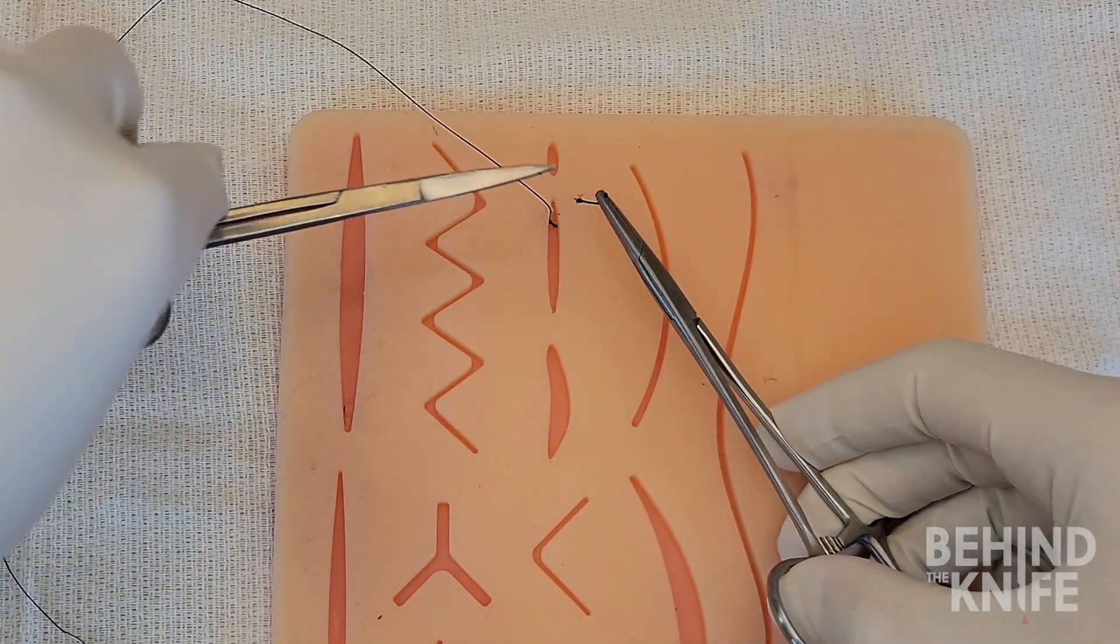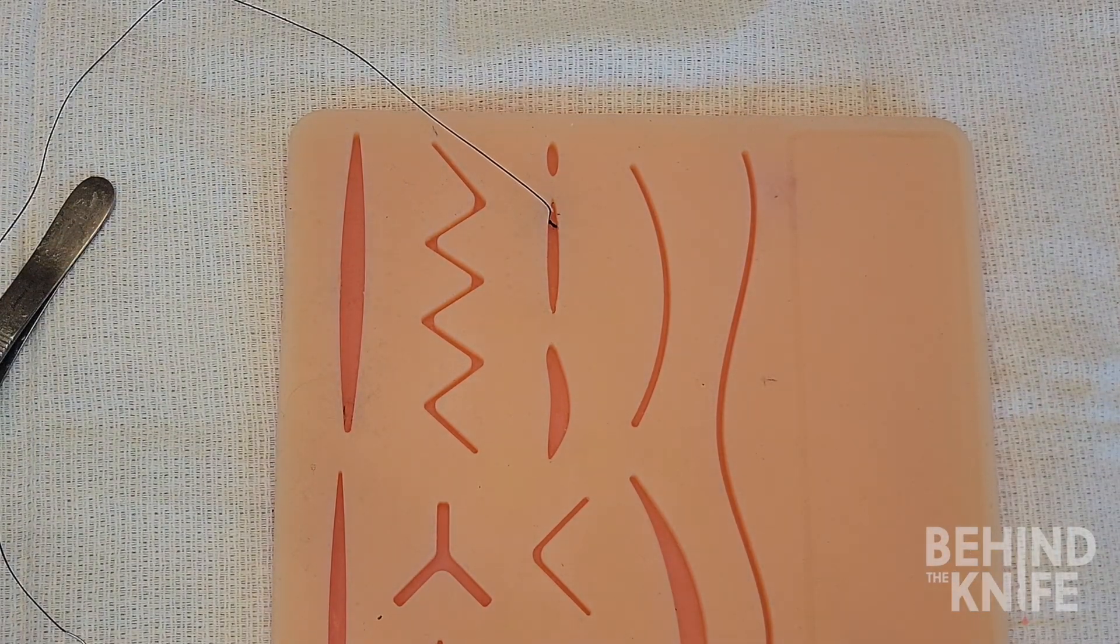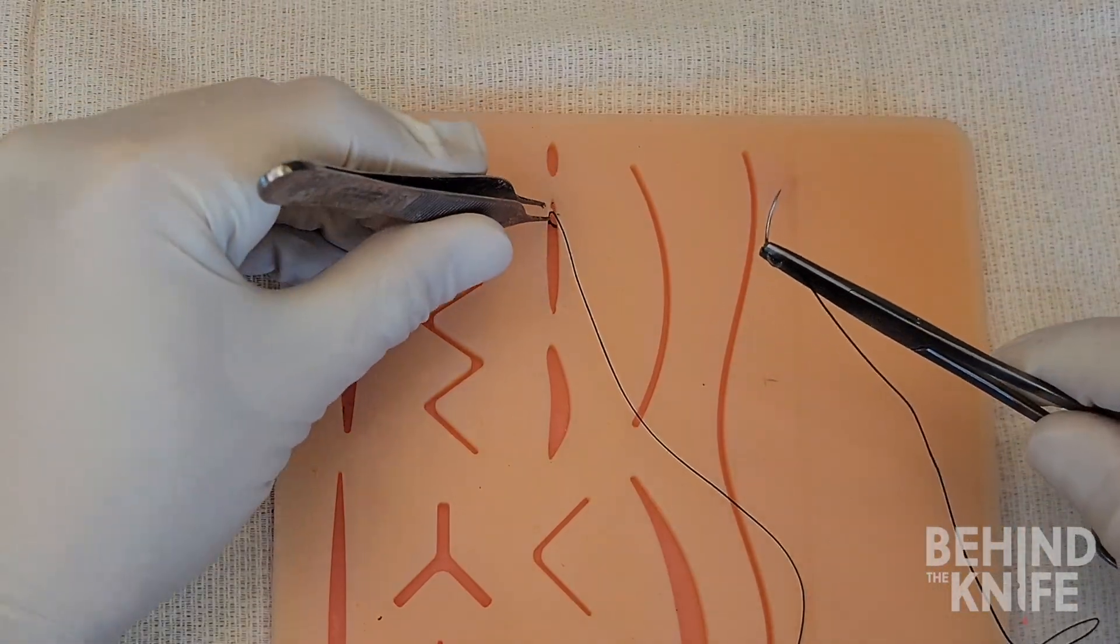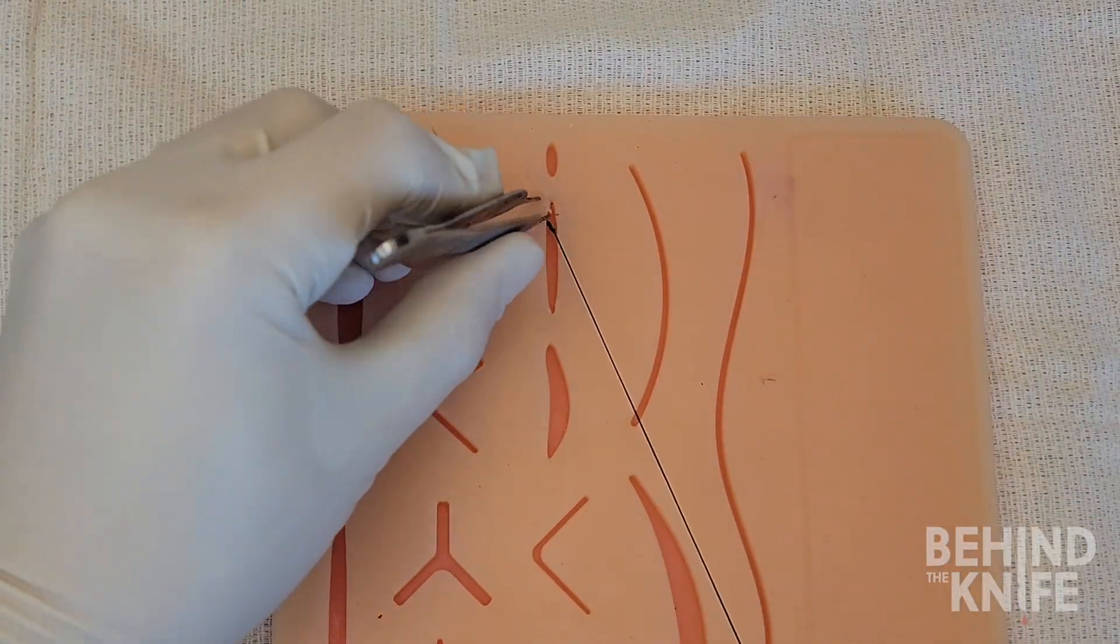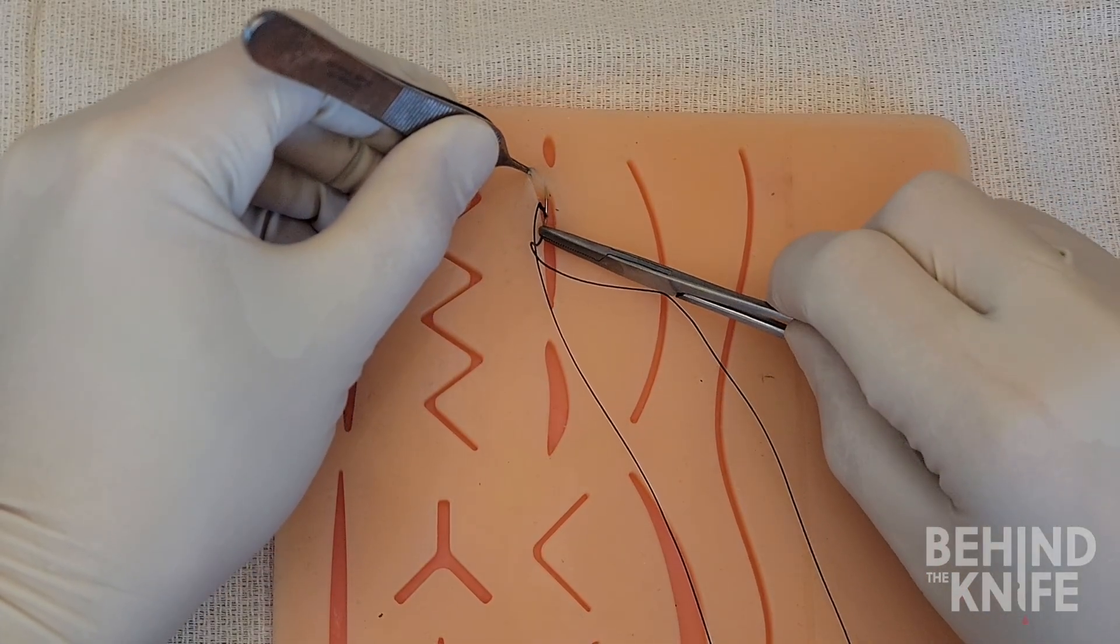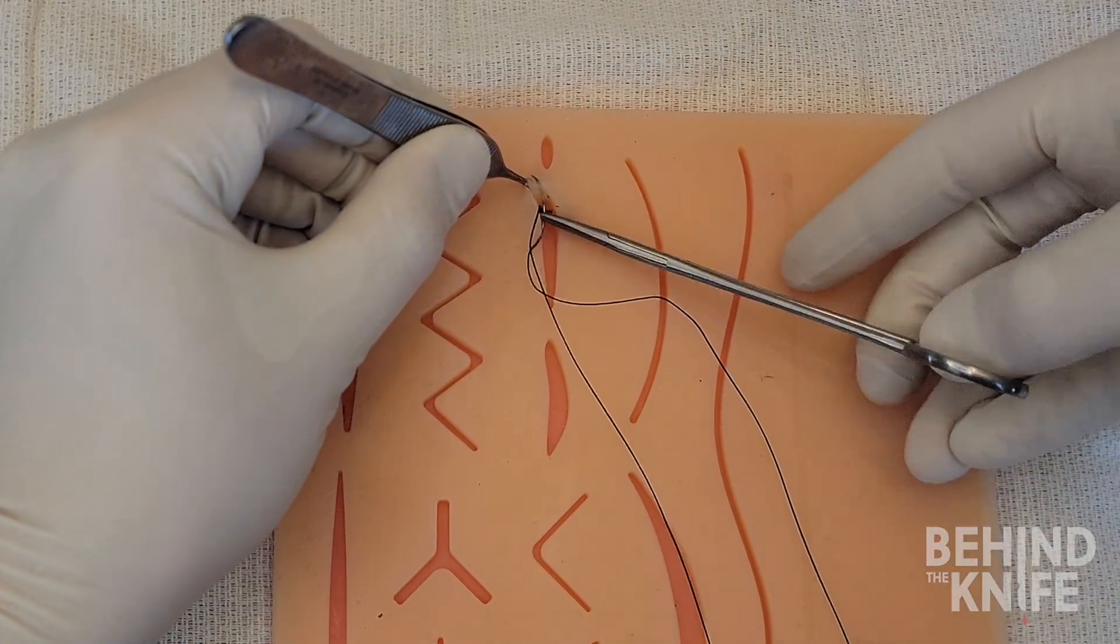After the knot is tied and the short end is trimmed, we will re-grasp the needle in the orientation for a backhand throw. From here, we will place the stitch at the top of the wound, starting in the dermis and coming out right at the apex at the dermal-epidermal junction.